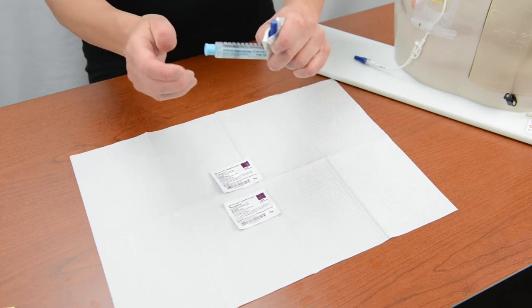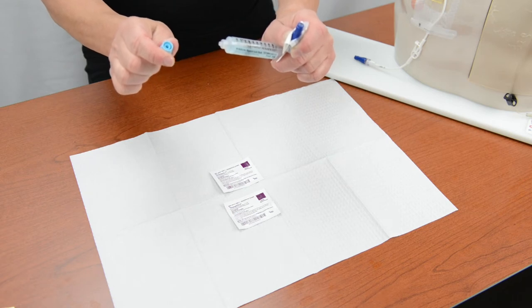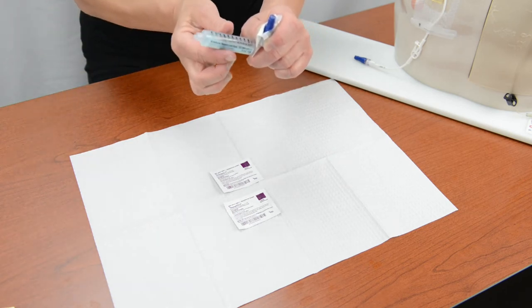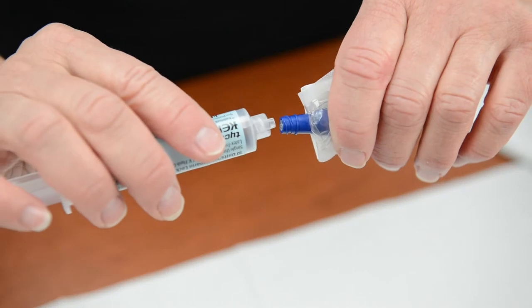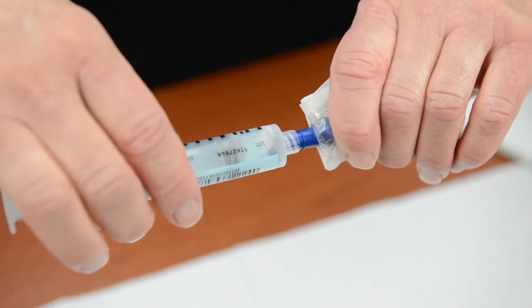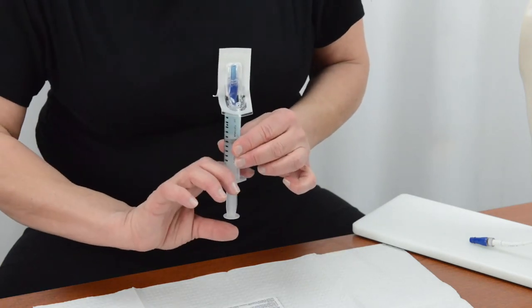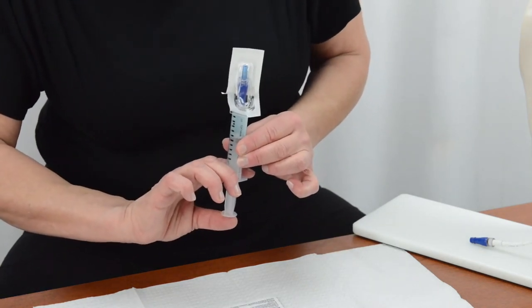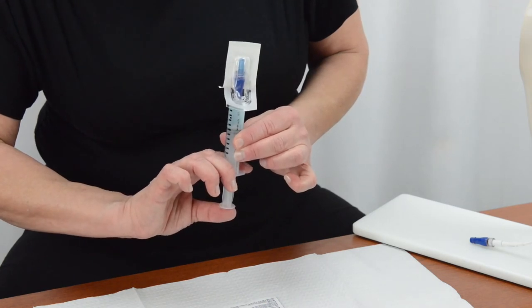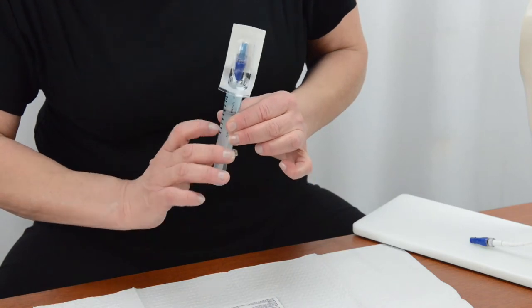Remove the cap from the syringe without touching the open end of the syringe, and put the cap into the trash. Connect the heparin syringe to the hub of the needleless connector. Then push up gently to push any air out of the syringe and the needleless connector. Keep pushing the plunger until you see a drop of fluid in the cap of the needleless connector.